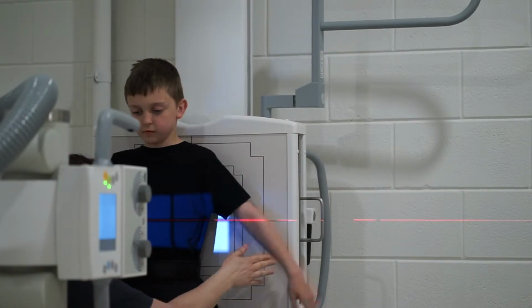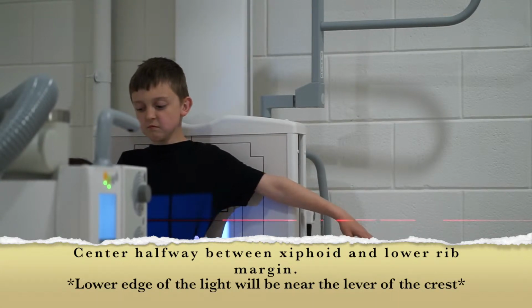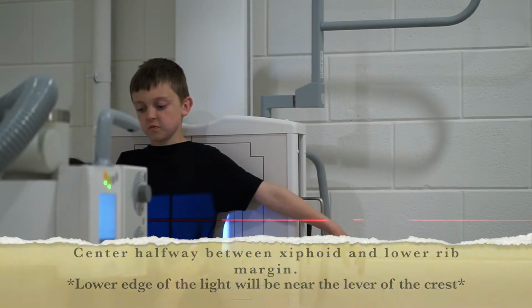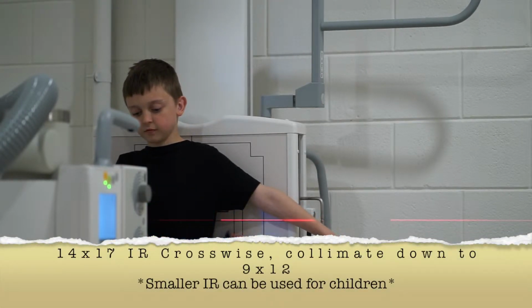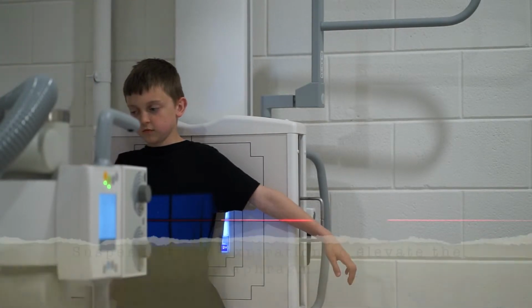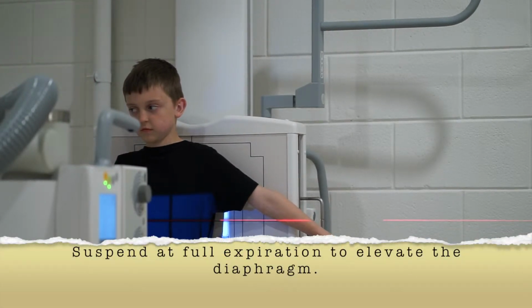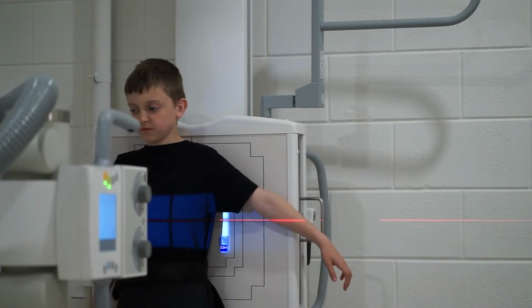Can you hold your arm out? Good job. Step over. Okay, this time I want you to take a deep breath in, blow it all out, and hold it out.